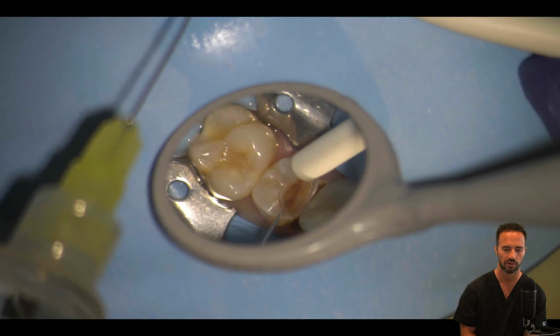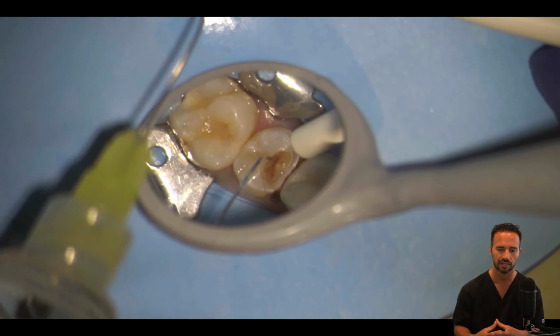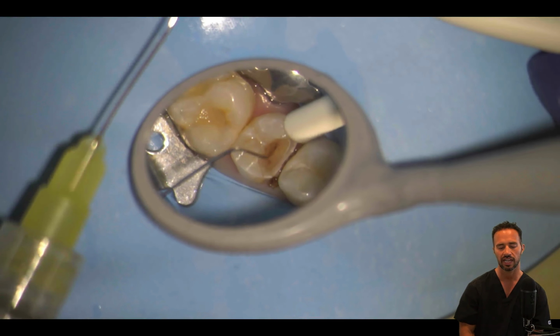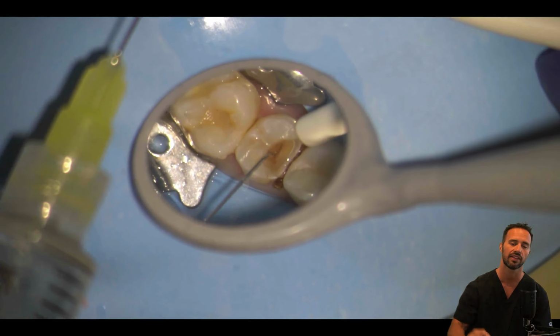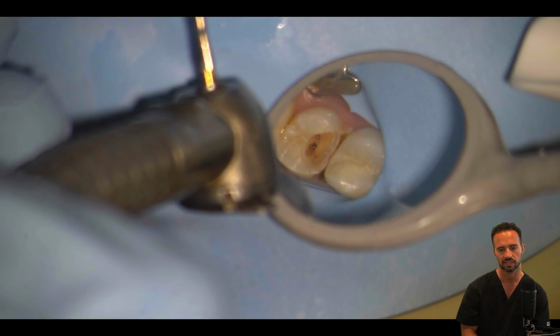So a little sodium hypochlorite here. Just be very careful because you don't have that airtight rubber dam isolation yet, because you don't have the Opal Dam Green material on there, to not let any sodium hypochlorite get into the patient's mouth. All right, so that looks, we get a nice sense of what the case looks like now.